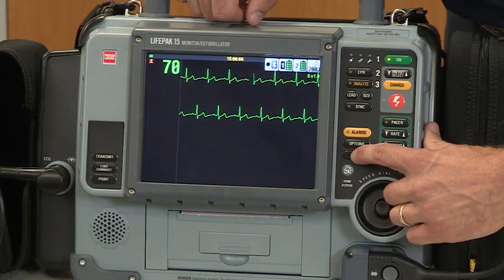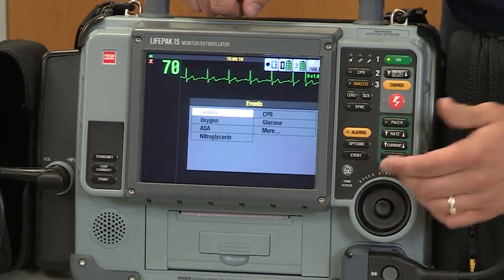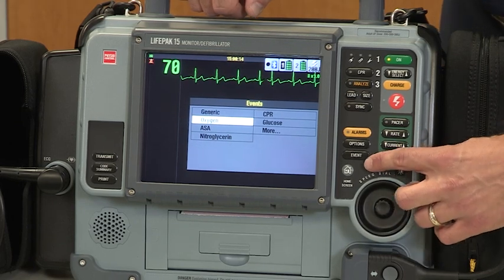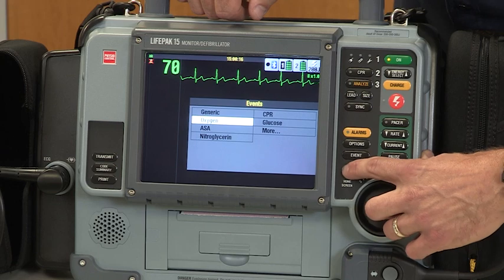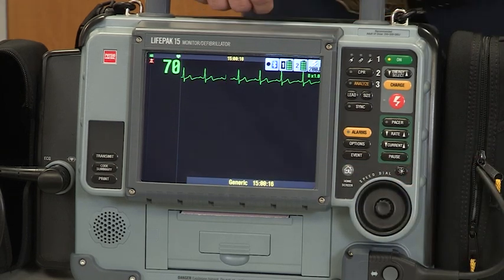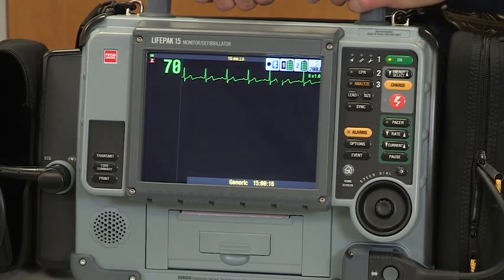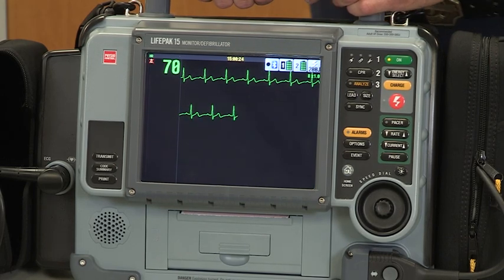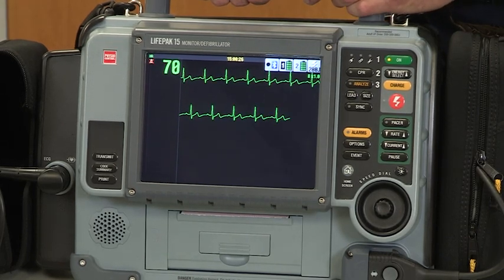Again, if you go to events and you don't want to be there, you can always depress the home button, and it'll take you back to the main screen. The home button will get you out of any screen that you don't want to be in if you think that you're there by accident or you just want to get out.